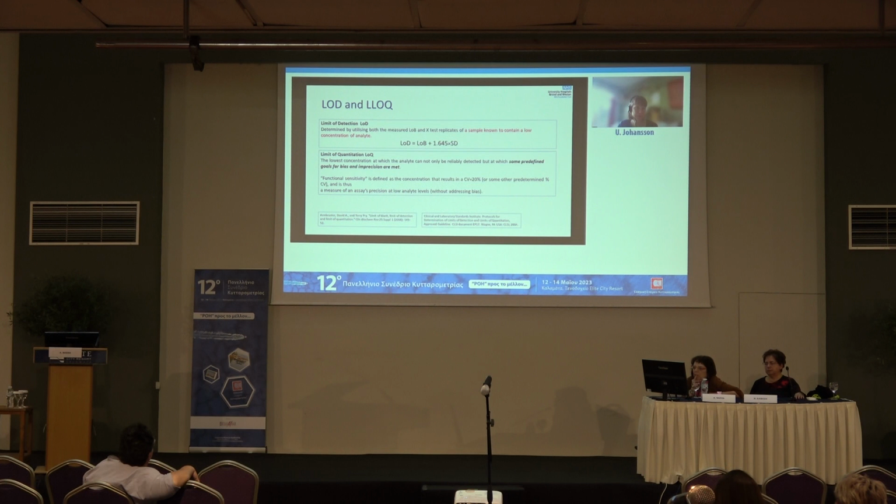And the limit of quantification can read a little bit differently depending on whether you read a very pure statistics paper like Armbruster and Pry. They've got one definition of this. In the H62, the definition is similar, but they say that you have to put it to the test, okay?